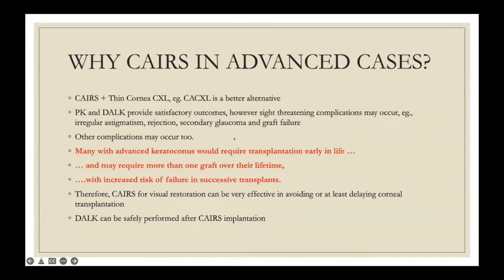And though PK and DALK do provide satisfactory outcomes, sight-threatening complications can occur. DALK is a beautiful technique, but it does have a much steeper learning curve, and you can have complications, intraoperative, postoperative, and the learning curve with CAIRS is really very, very simple. It's a much easier surgery to do, and the postoperative period is also much smoother. You can just have steroids for about 4 to 6 weeks, and the patient really does extremely well.